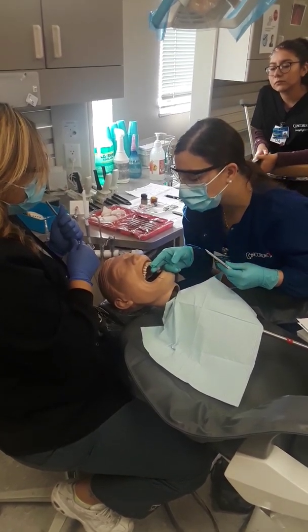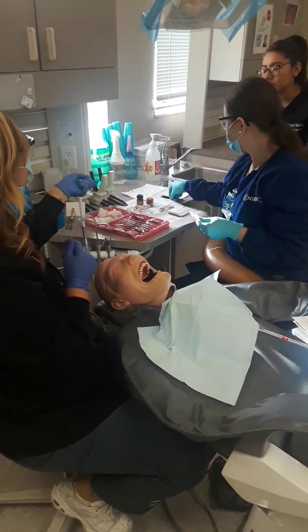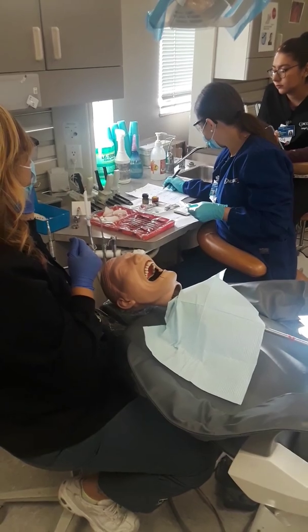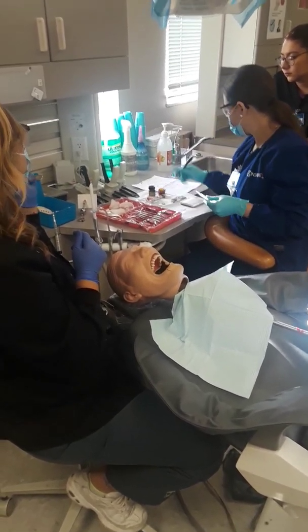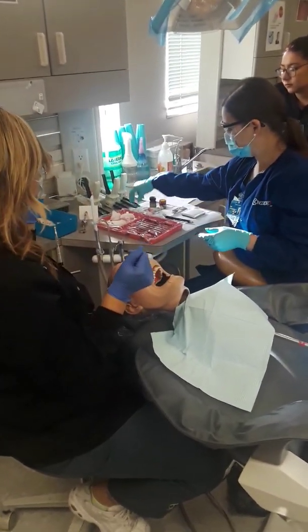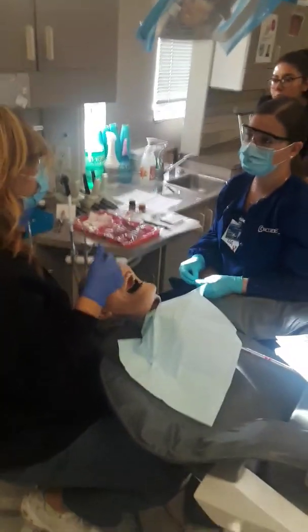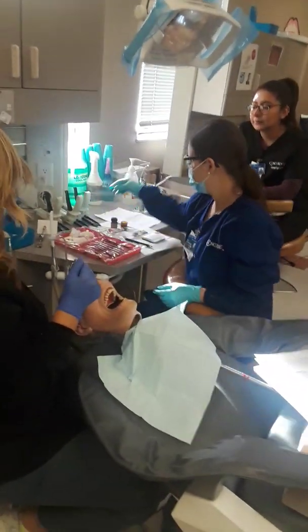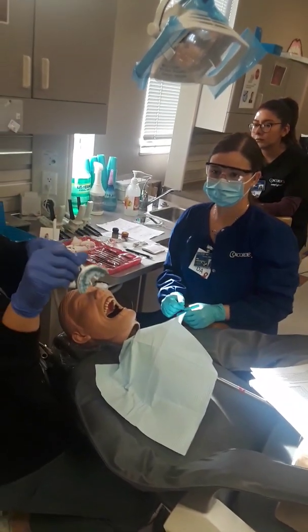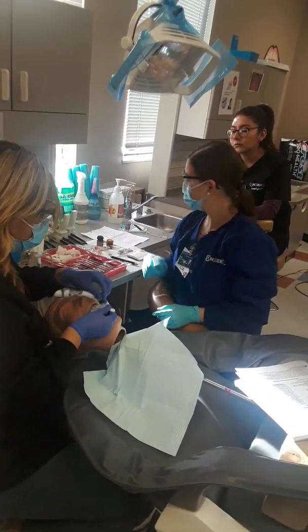Looking like A2? Okay, she's going to write A2 on her lab sheet, because remember crown prep, you want to pull out your lab slip. Okay. Then we want to take a preliminary impression. We're like a cooking show, so I already have it ready to go for you. This is a preliminary impression. So it's already made.